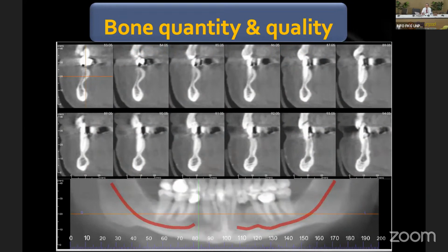Now this just shows that if you just look at the panoramic view, you can see the bone height, but you probably don't see the bone width. There's some sort of depression in the anterior aspect of the mandible.